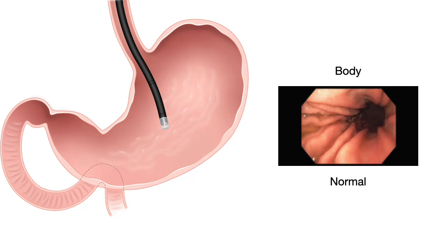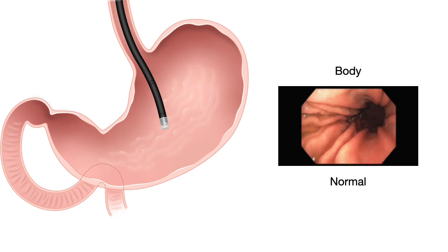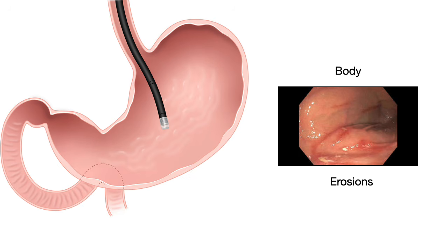All right. And patients who drink heavily or take aspirin or ibuprofen, etc. for pain, then they may develop erosions or gastric erosions, and you can see slight streaks of red with a little bit of yellow area in the center. These are gastric erosions. So normal, gastric erosions.